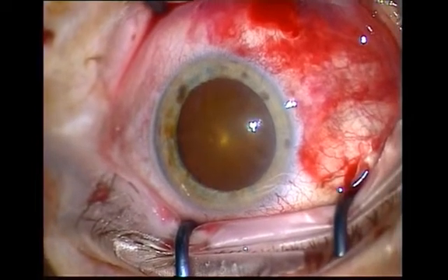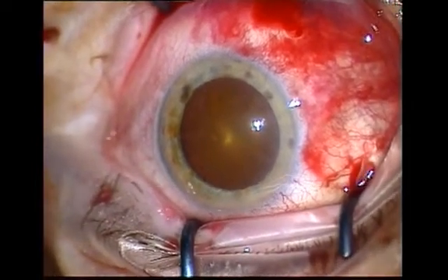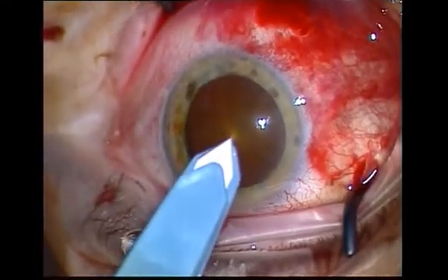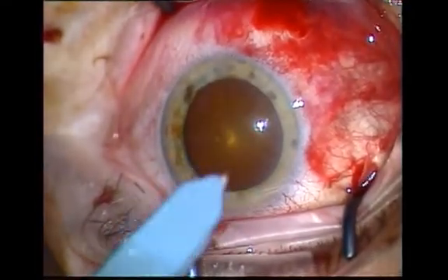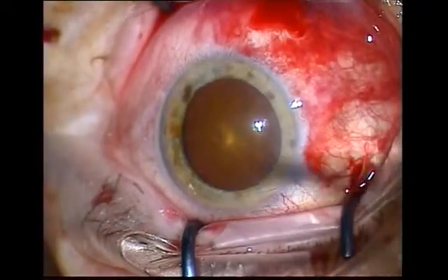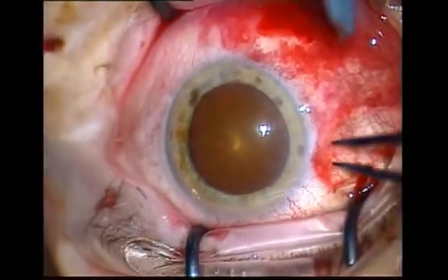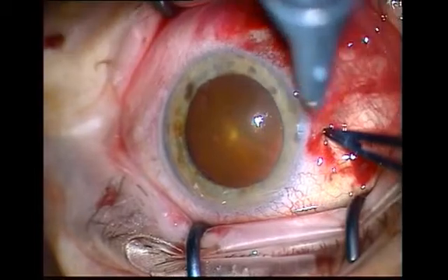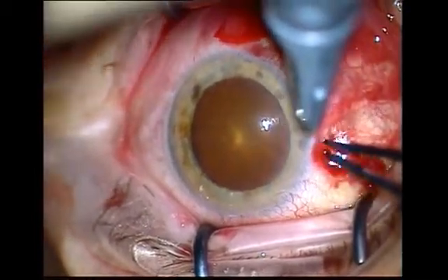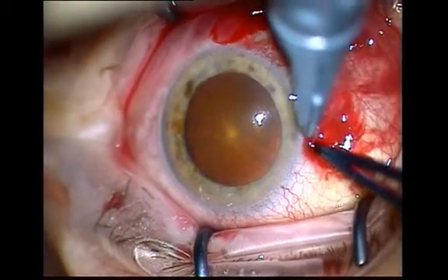Arcuate keratotomies represent a simple procedure to reduce the level of corneal astigmatism. This should be carried out just inside the limbal blood vessels in clear cornea, centred upon the steep axis of the cornea — that is, the axis of the positive refractive cylinder.